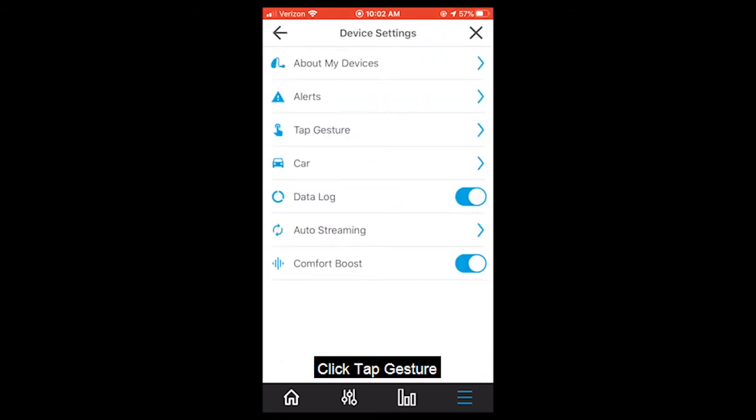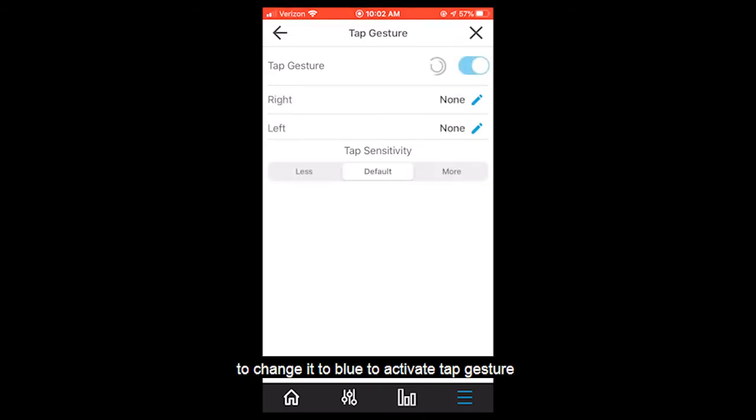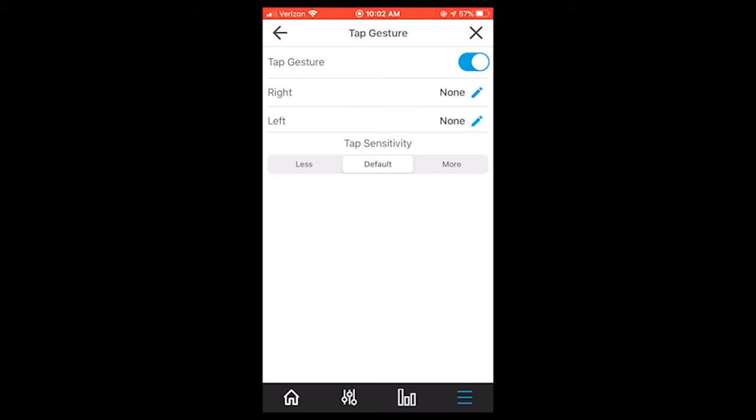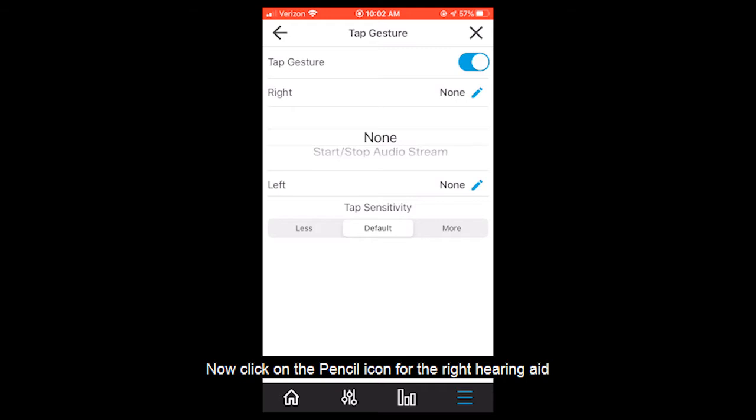Click tap gesture. Click the gray button in the upper right corner to change it to blue to activate tap gesture. Now click on the pencil icon for the right hearing aid.